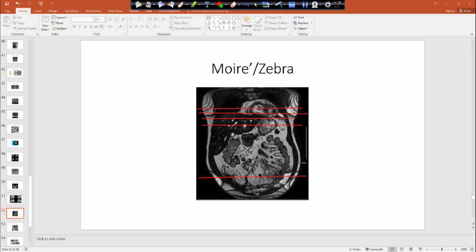So this is a quick, could be a T2 sequence, which remember is our normal free breathing technique. So we still get that artifact, but it's not really as big of an issue because we're more concerned with the axial slices in the abdomen than the coronal. So this artifact doesn't show up on the axial slices? Nope, because we don't worry about the arms wrapping in on the axial slice because we go A to P.